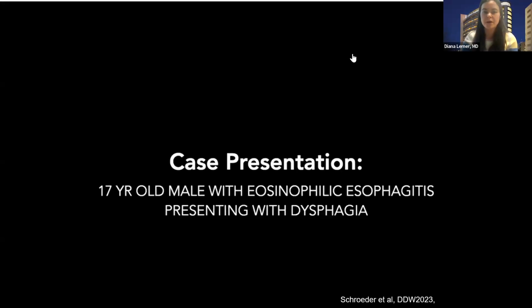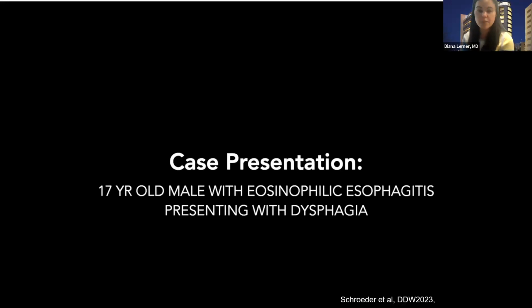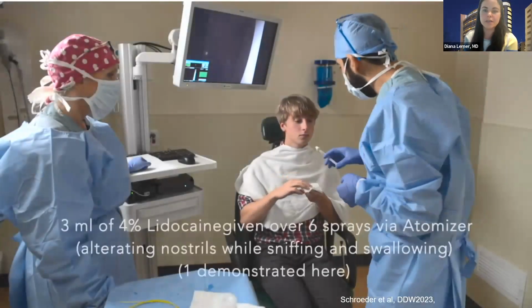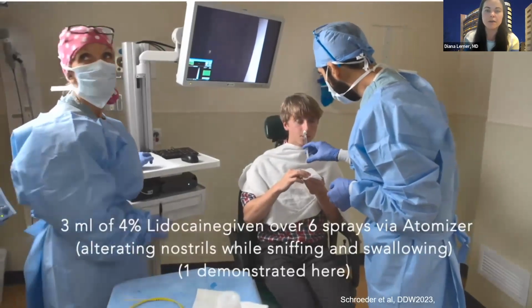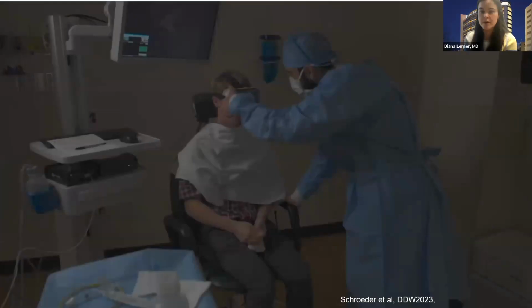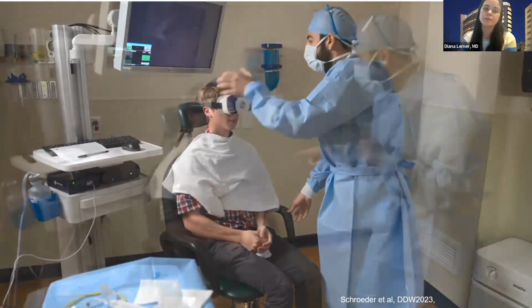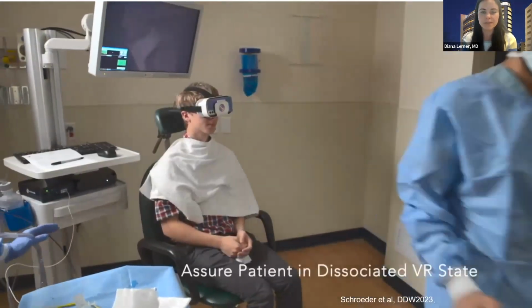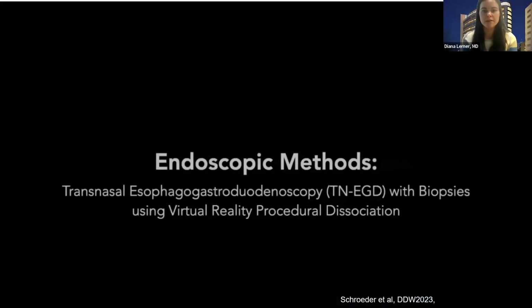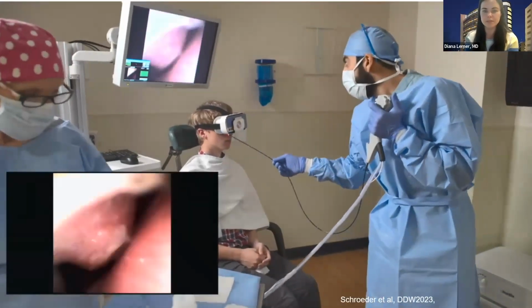So I wanted to show you briefly this presentation. This was a case in a video that was presented at DDW this year, just in general what this looks like. So at first, you're going to see Dr. Mami administering nasal lidocaine via the atomizer. And then putting a little bit of it on the nasal Q-tip around the orifice of the nasal entry. They're ensuring that the distraction system is working. You can see he's adjusting the chair to ensure that the nose is at the chest level, and that helps keep the scope stable.